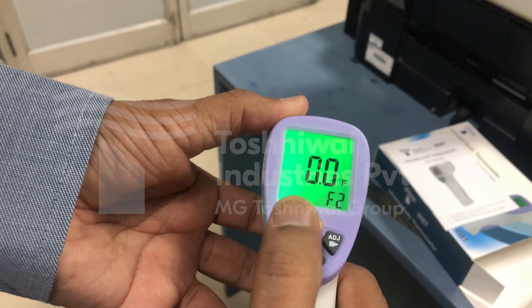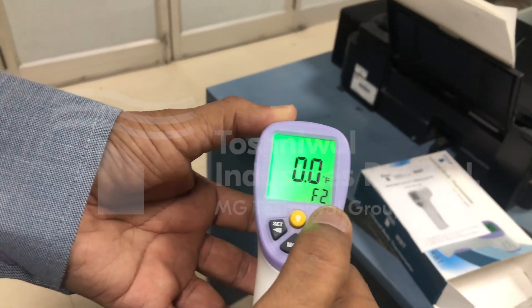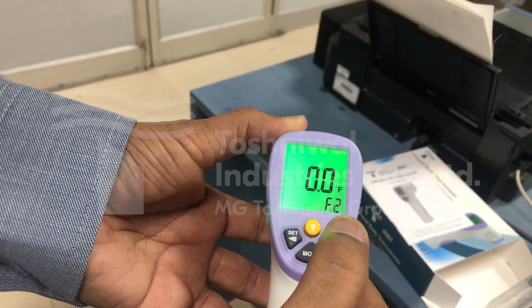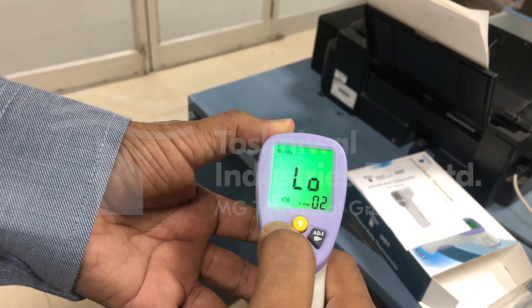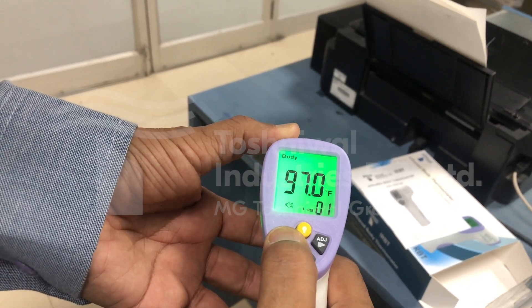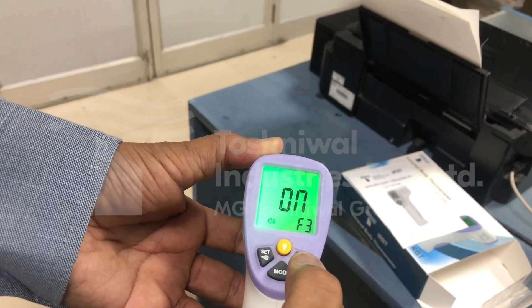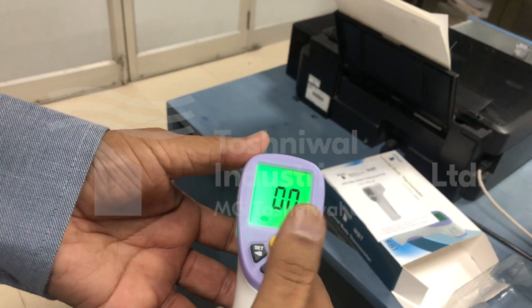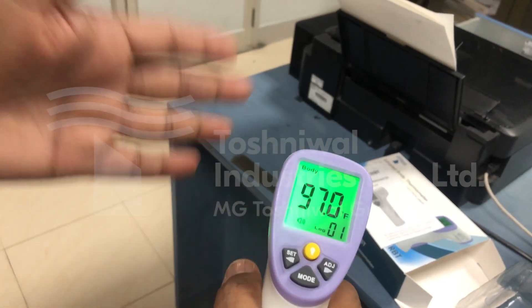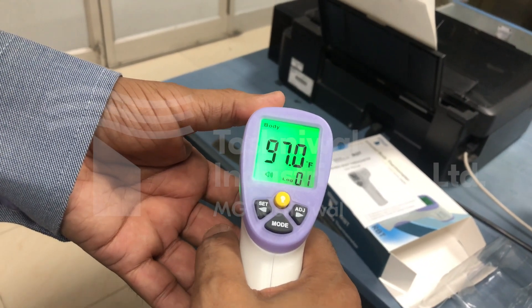Pressing this again — this is an error correction which would be useful when the instrument is used for a long time and you want to do some correction of error. And this is F3, which is for the beep to be on or off — it's on at the moment. So right now the instrument is all set up in degree Fahrenheit mode and I can do some measurements.